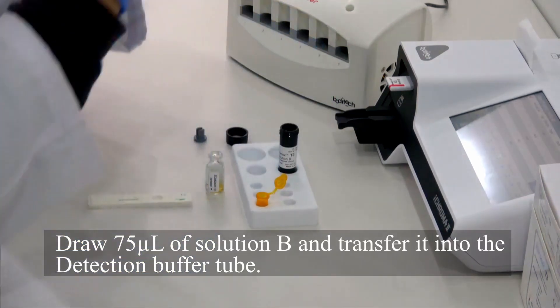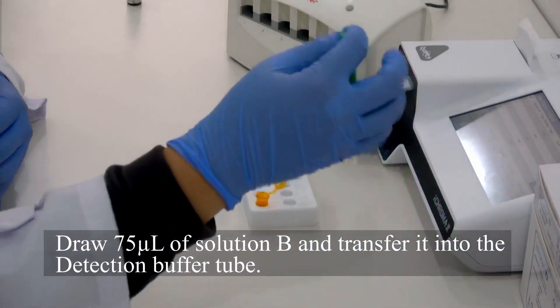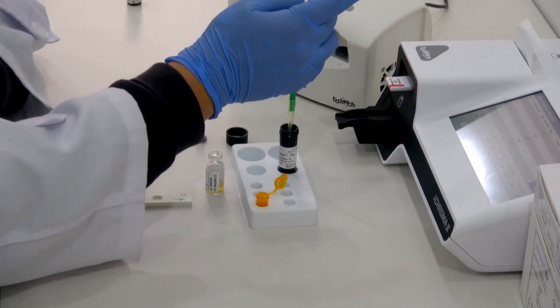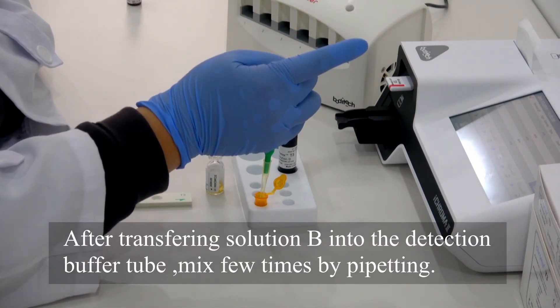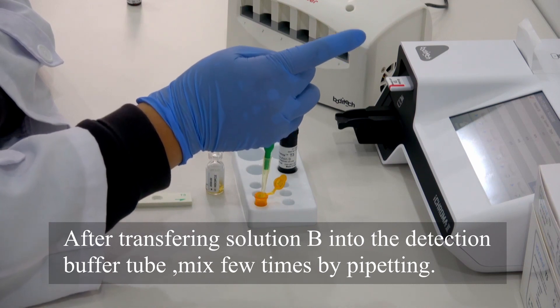Draw 75 µL of Solution B and transfer it into the detection buffer tube. After transferring Solution B into the detection buffer tube, mix a few times by pipetting.